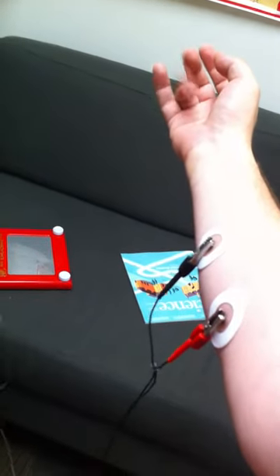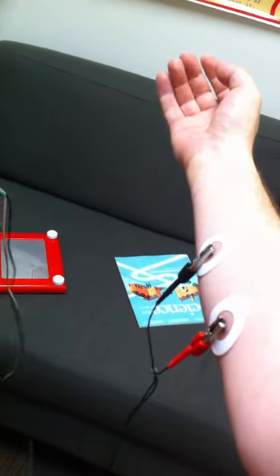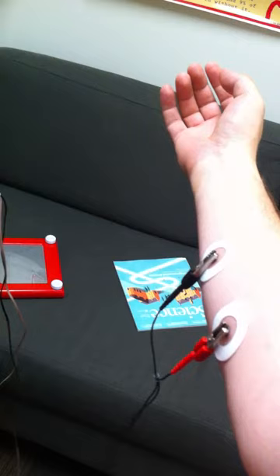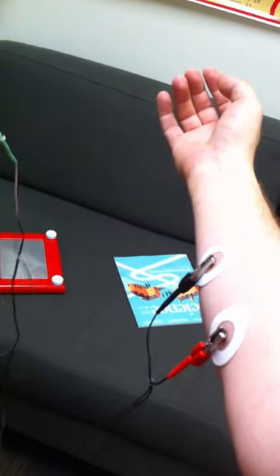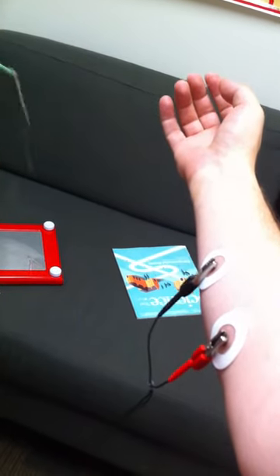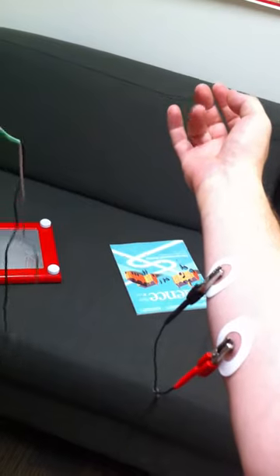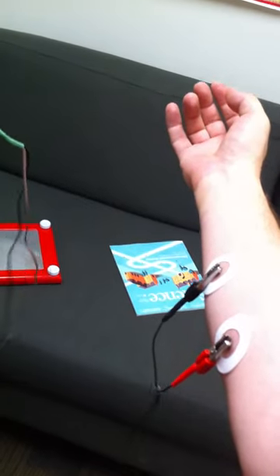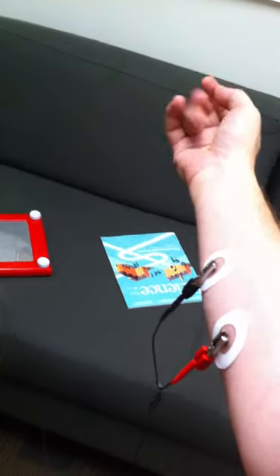Okay. Do it like low strength but high frequency. Whoa! Ooh, that tickles! Holy shit! That tickles really weird. Whoa! Okay!